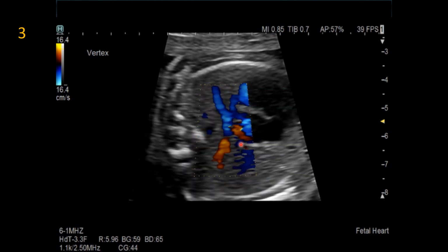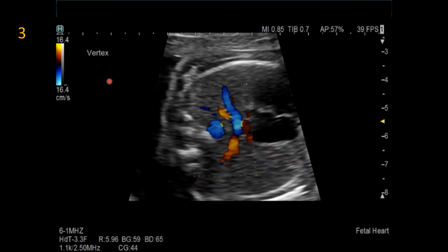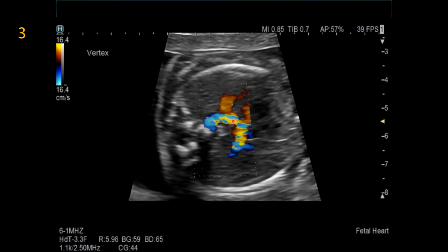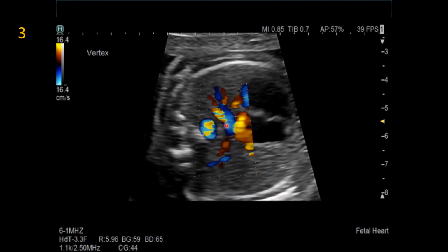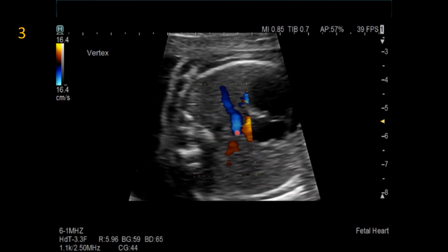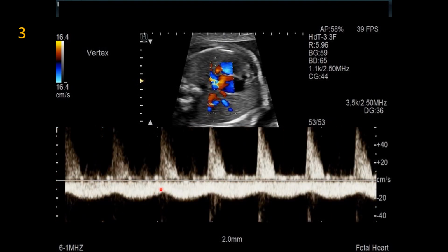Color Doppler, looking at the pulmonary veins, you can see this continuous flow here. Again, we want to make sure that the scale is very low to interrogate this. And then looking at the left pulmonary venous system and the right pulmonary venous system here, connecting to that confluence and then draining with continuous flow. Looking at the right pulmonary vein with spectral Doppler is very, very characteristic of downstream obstruction, and also that left side, so they connect to that confluence together and drain to that venous structure which drains below the diaphragm.